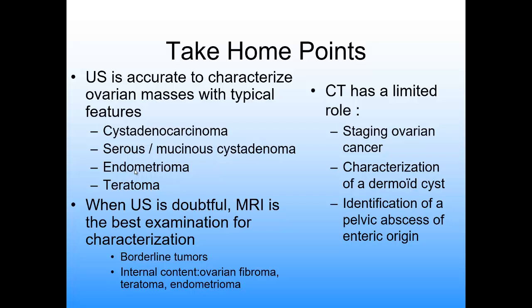Sometimes I find some of our colleagues say chocolate cyst. Chocolate cyst is not a radiological diagnosis. It's a pathological diagnosis. So endometrioma is not said on ultrasound, except if it is proven before that the patient has endometriosis, either by laparoscopy or whatever, but if not so, you just say that it is a benign-looking echogenic cystic lesion in the ovary, likely endometrioma.